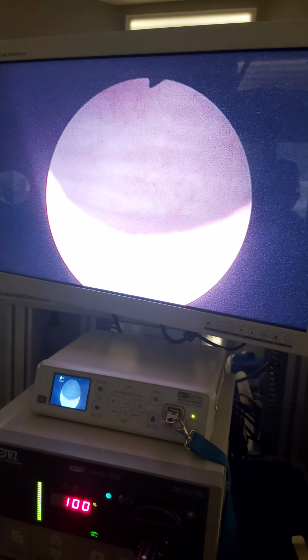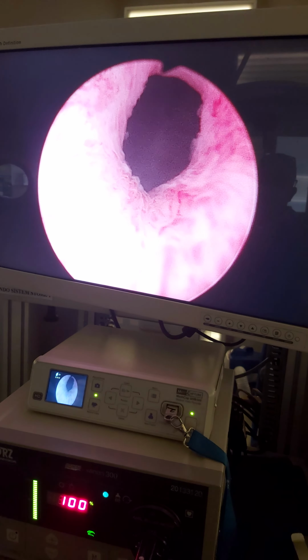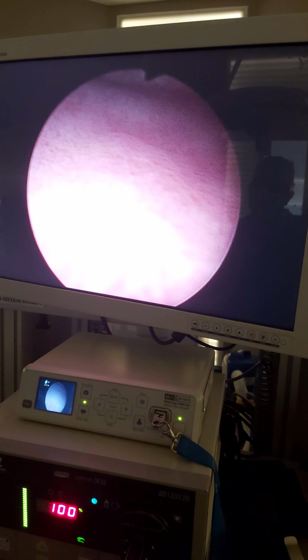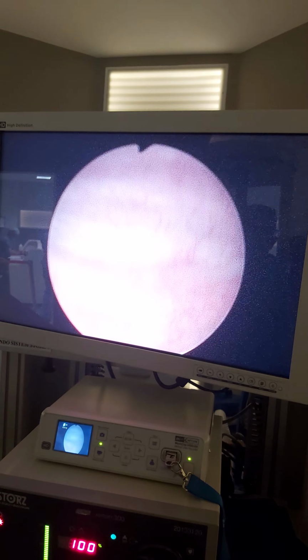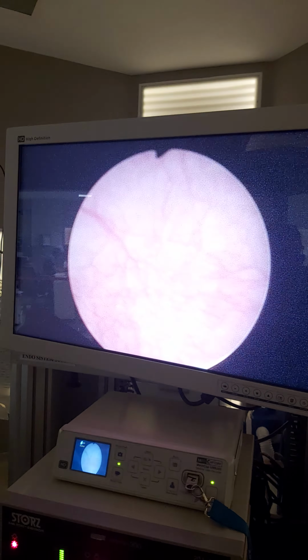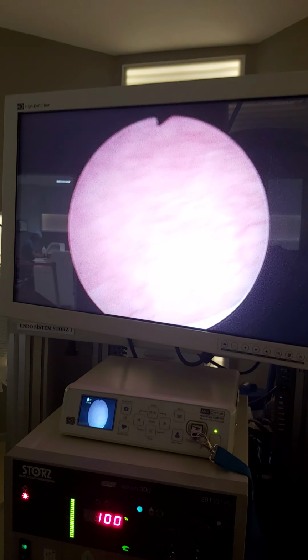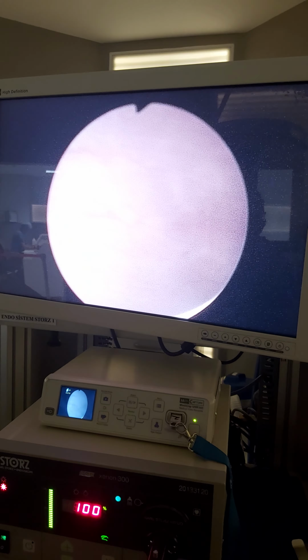So the bacteria goes inside the bladder from the urethra here. This is the urethra. It looks healthy. The bacteria enters and settles first in this part of the bladder, which is the entrance of the bladder. Then it disseminates into this part, the opposite wall, which is in contact with the trigone when the bladder is emptied.